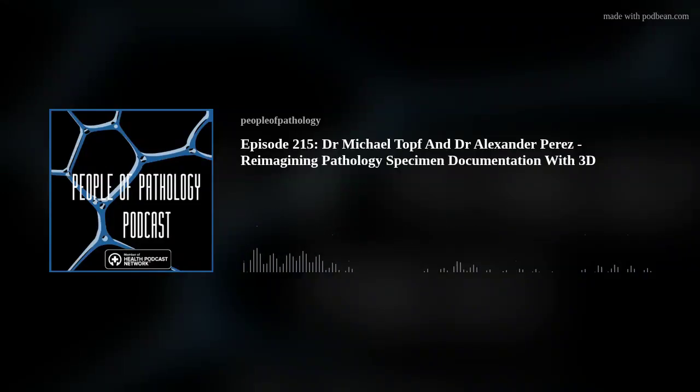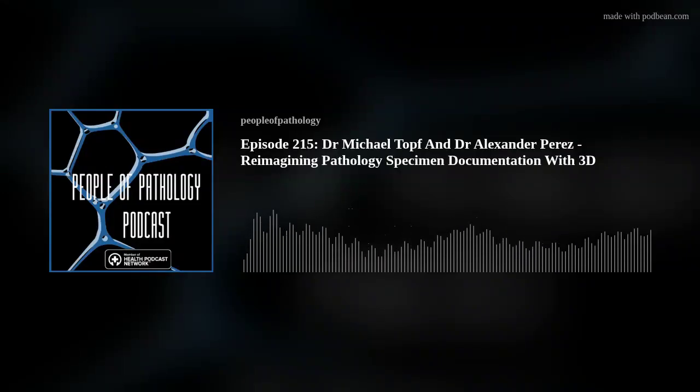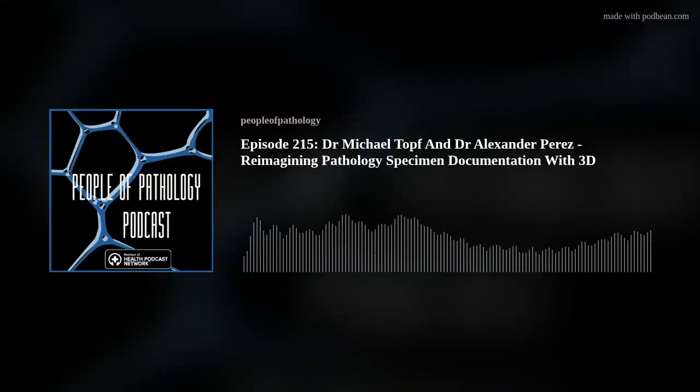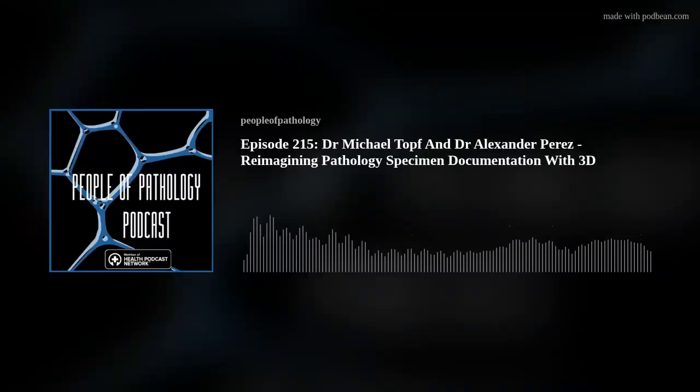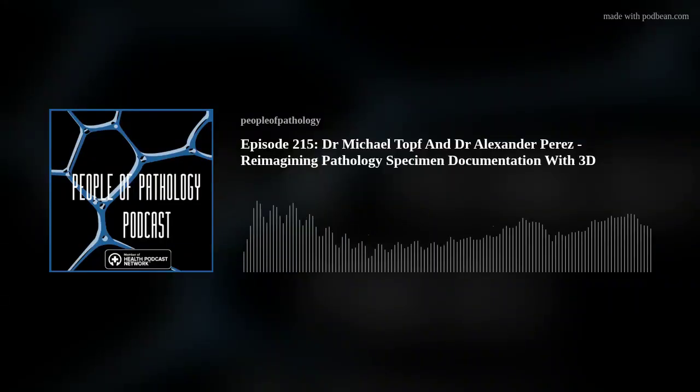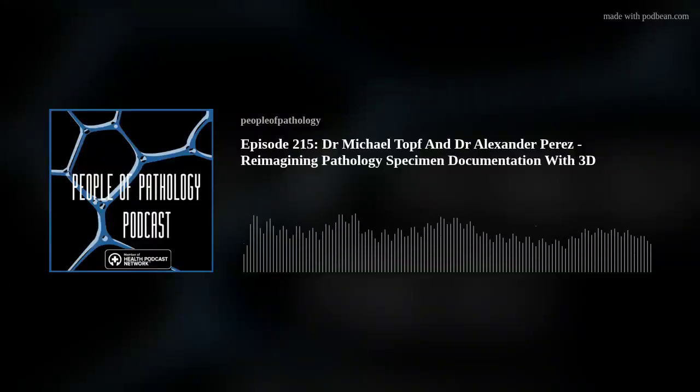Now, I will tell you, there are oftentimes more than one person there for our team, just because we've got a lot of team and strength in numbers, and we're trying to scan as many specimens as possible on a given day. The preference is to scan locally advanced cases that are more likely to have a close or positive margin, because that's where these visual pathology reports or 3D specimen maps are most useful.